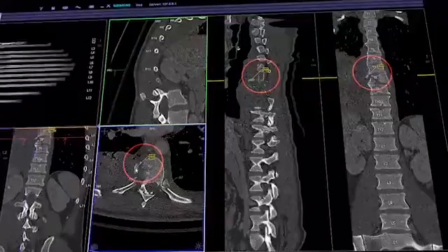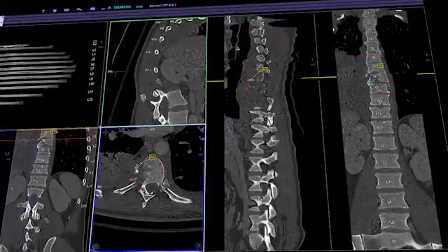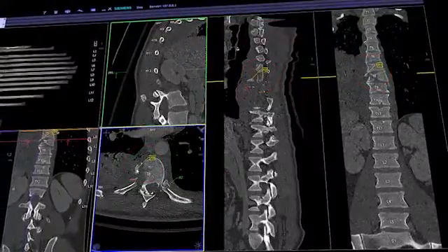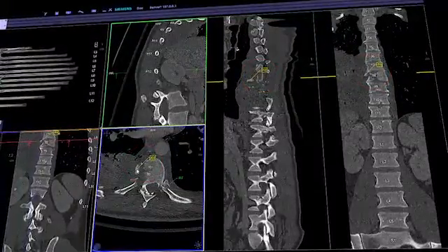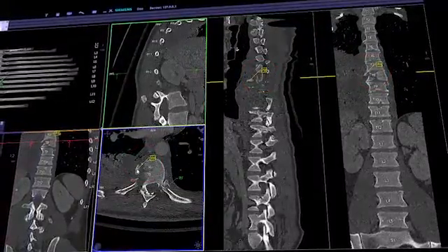Syngo CT Bone Reading — for increased speed in bone assessment.